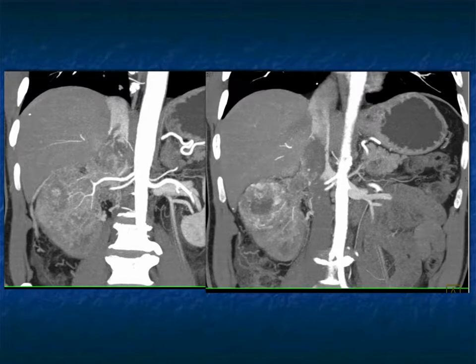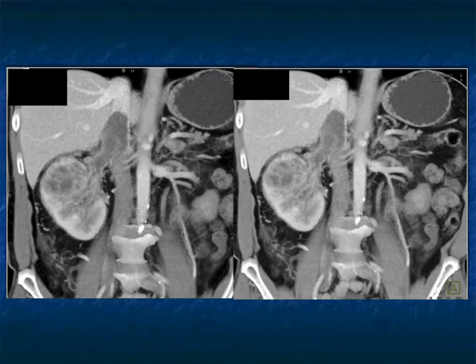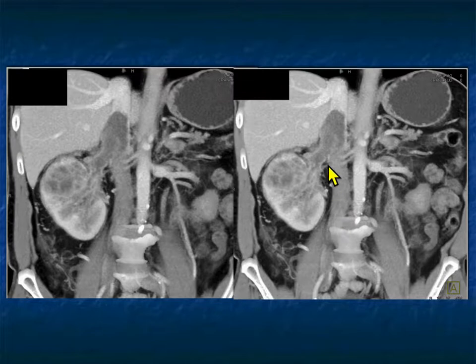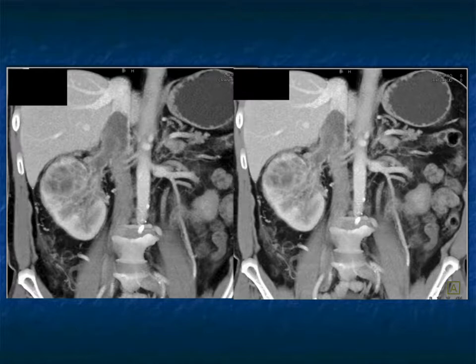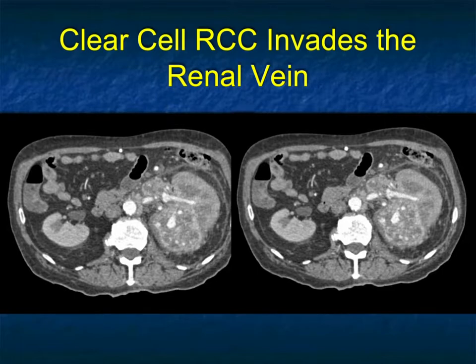Here it is again showing the two renal arteries, the thrombus, and lots of neovascularity. When you get to venous phase imaging you really can see the true extent inferiorly — the extent into the renal vein and up into the IVC. It's intrahepatic IVC but it's not intracardiac IVC.